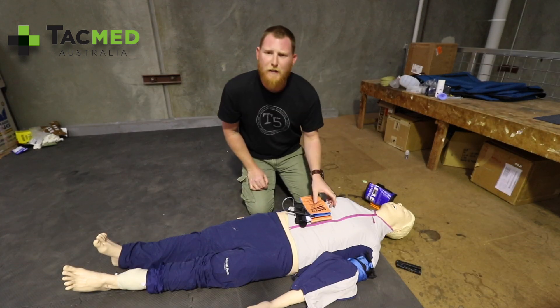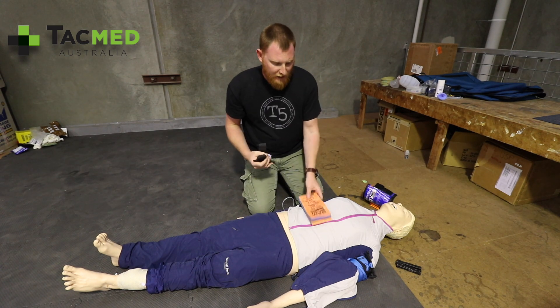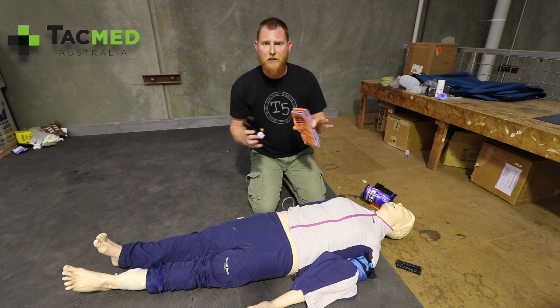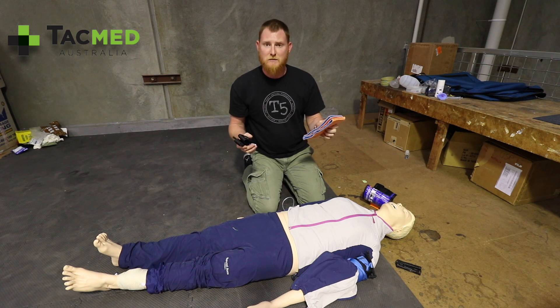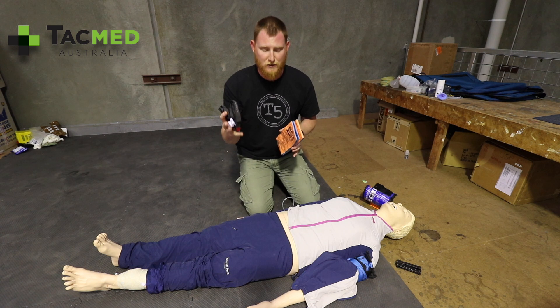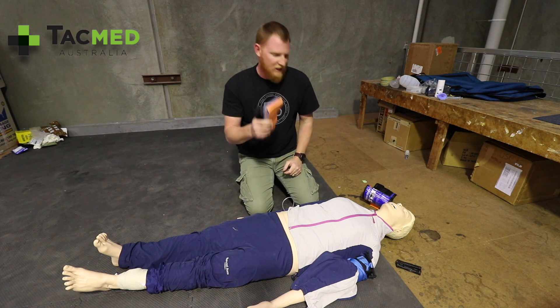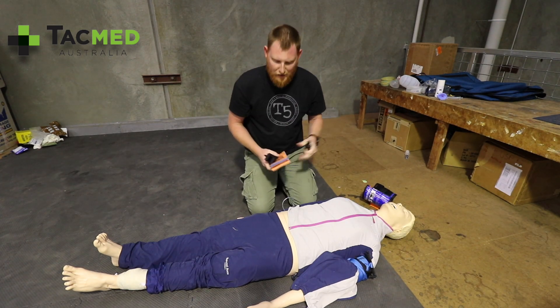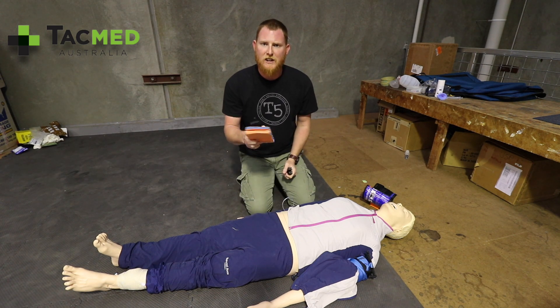Obviously we have commercially available splints like the SAM Pelvic Sling — these are great, very effective, and easy to put on — but we don't always carry them, especially remote and military medics. Two of my favourite bits of kit are the CAT Tourniquet and a SAM Splint. I don't think I have a first aid kit or trauma kit that doesn't have these two items. With these two bits of kit and a Leatherman or any knife, we can improvise a pelvic splint. I'm going to show you how now.